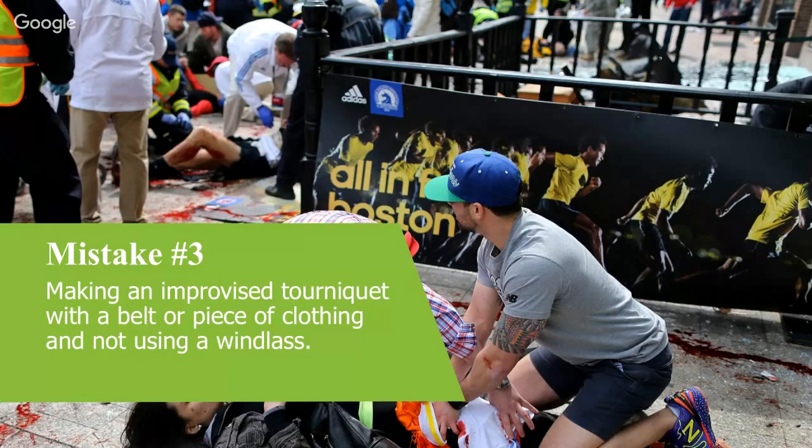You might find yourself in a situation where you need to improvise, and that's where we need to make sure you're using a windlass. And Jez has already mentioned that if you're putting, say, a belt on and you don't tighten it to occlude the artery, but you do tighten it tight enough to occlude the venous system, you cut off the veins, then blood can't get out of the limb, but it can still get into the limb, and that worsens prognosis.